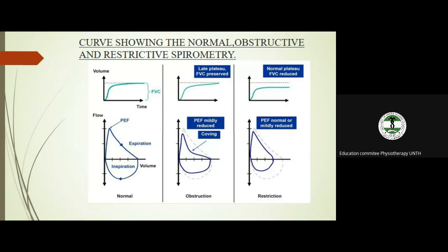You can see the contour shape of the curve. Okay, pointer. You can see the curve. This one is mildly reduced.